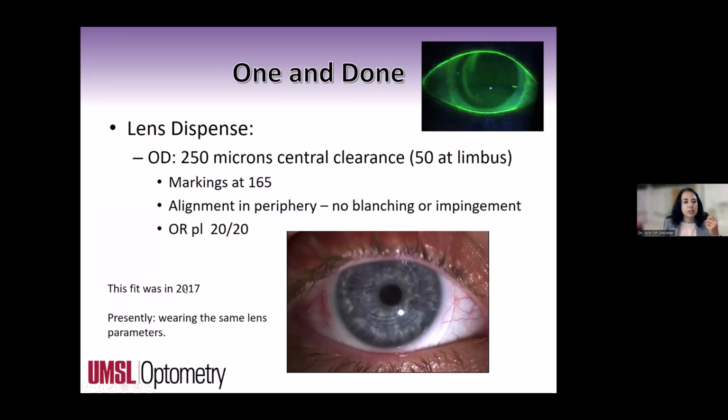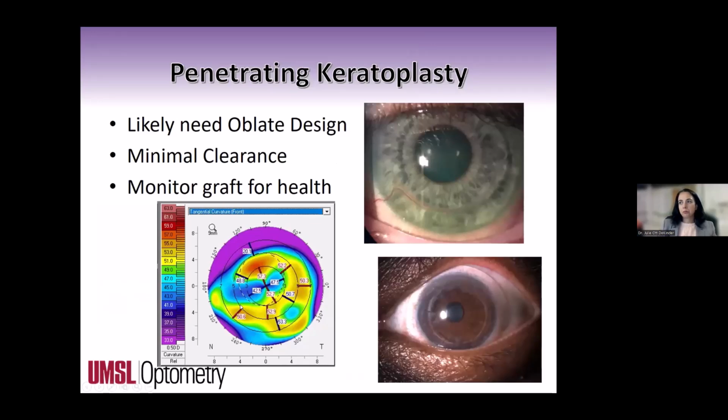That was 2017, wearing the same lens today. Well, not the same lens, but the exact same lens parameters. I haven't had to change a thing since that. Put one lens on his eye, modified from it. In this case, I got very lucky, didn't have to modify a lot. And now we've got that he's wearing the same lens all these years later.